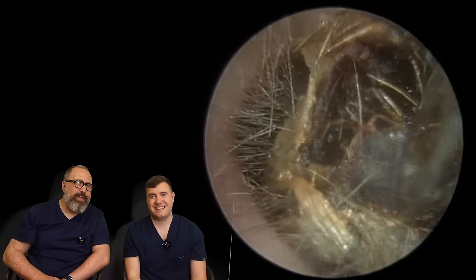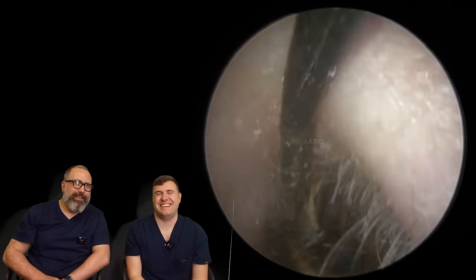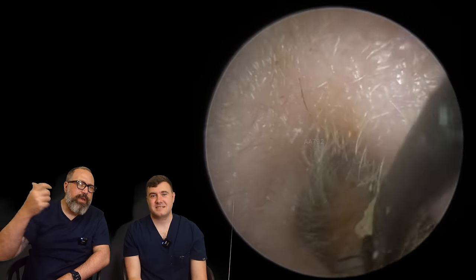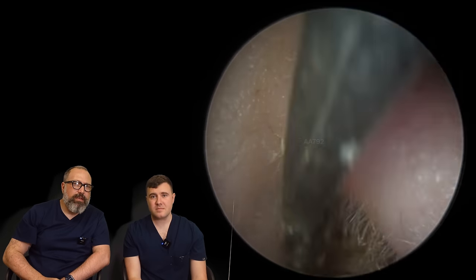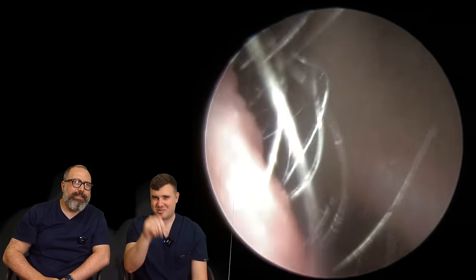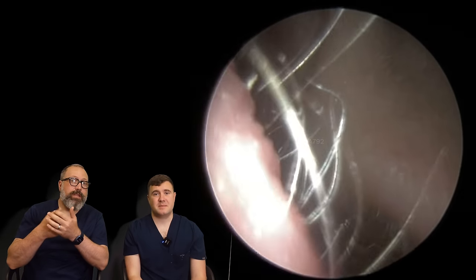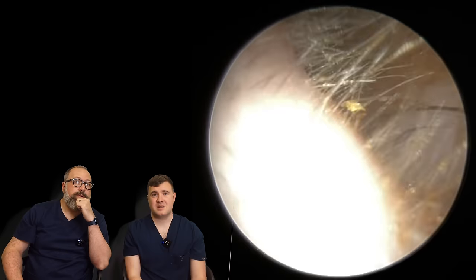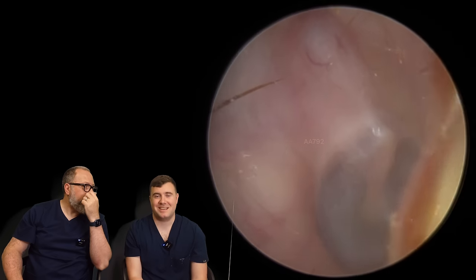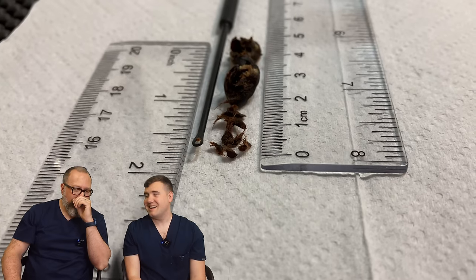Look at that — it's a little bird's nest. And all that skin as well underneath it — you can see that grey, beige-y kind of layer underneath there. Again, struggling to pick it up, trying to find a spot to poke into it. Some of them are just so tough and dry, you just can't even get the tools into them. We always try to avoid dropping these on the patient as well. It's pretty much if they hit the floor they just go dunk. Look at the size of those plugs.